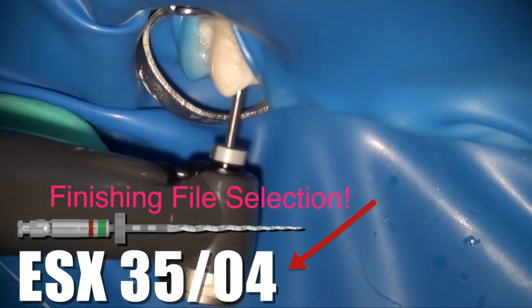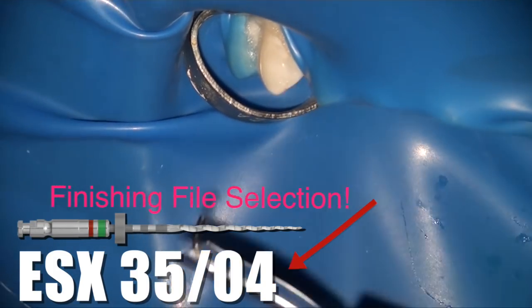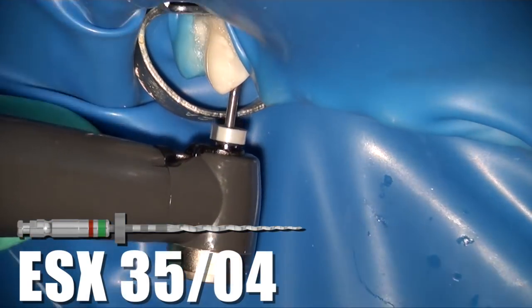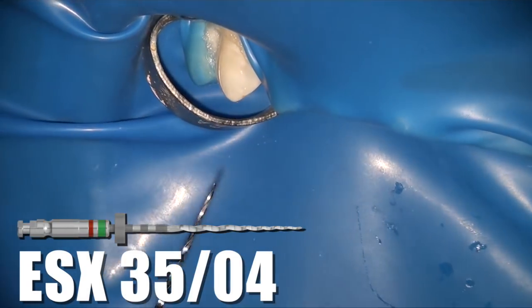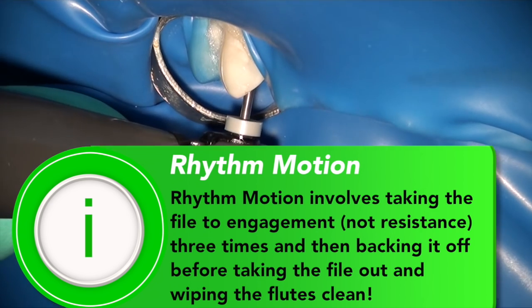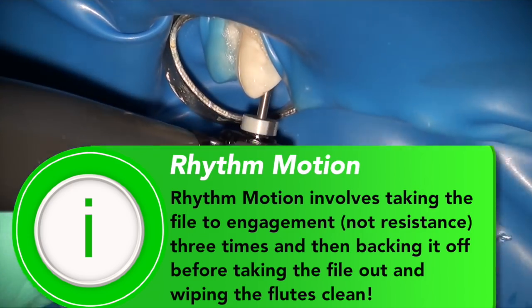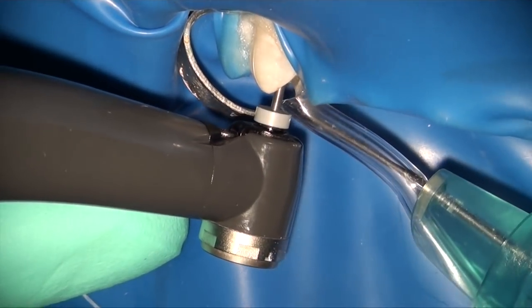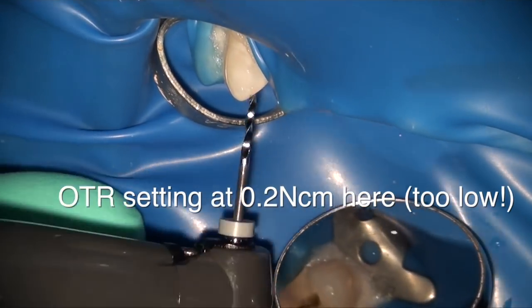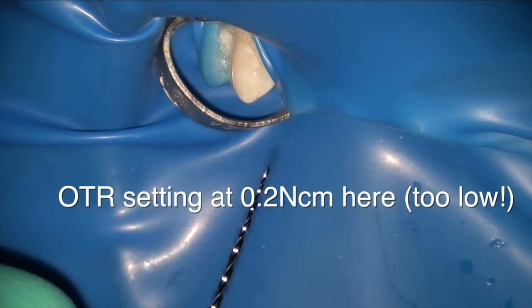We choose a size 3504 as the finishing file for both canals, and now the goal is to get the 3504 down to the apex in each canal using rhythm motion followed by wiping. You can see that each time I take a stroke it's engaging the OTR, which means it almost turns into a reciprocation-type motion. Frankly, I think I set the OTR at 0.2 a little too low for this case — I could have probably raised it to 0.6 and been a lot more efficient in my cutting.